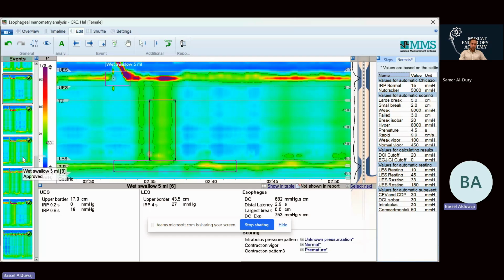It's not that complicated to know, but I think, I don't know if you agree with me, it's how to select the right treatment, if it is achalasia type 1 or 2 or 3. I think that's most difficult rather than the diagnosis. Diagnosis could be predictable by the scope, then it could be conclusive by the manometry. Then it will be the job of the physician or the gastroenterologist or the surgeon to select the right treatment.